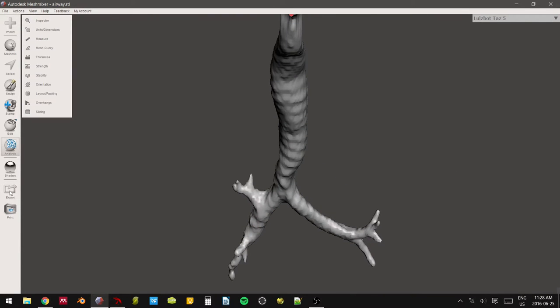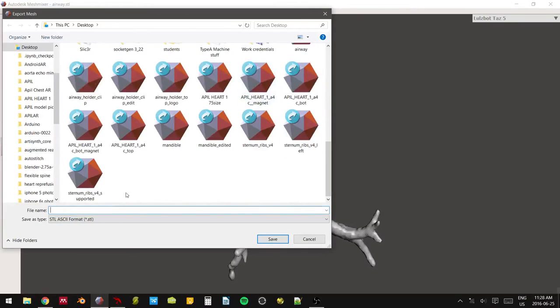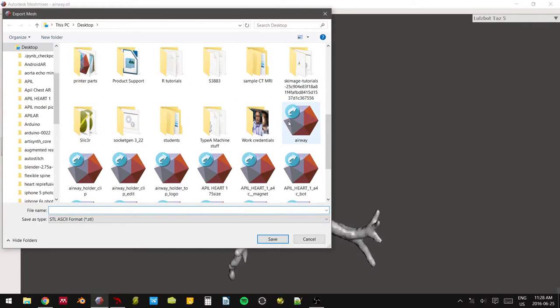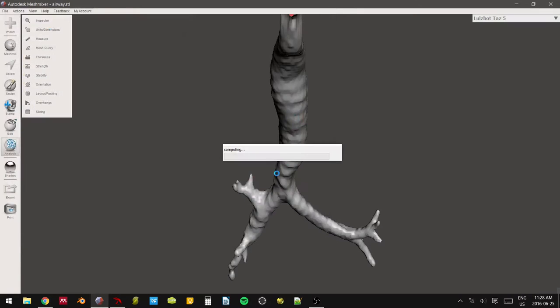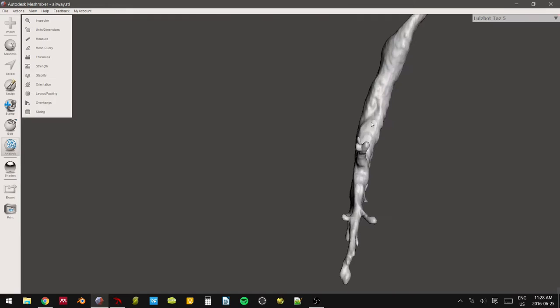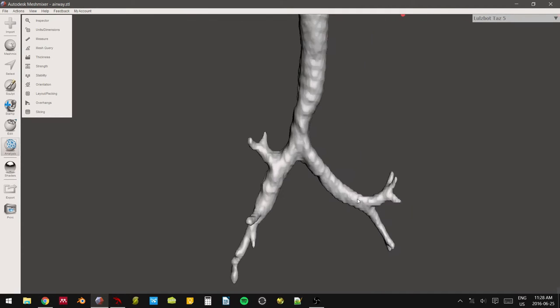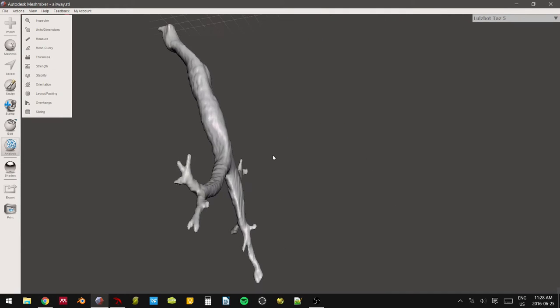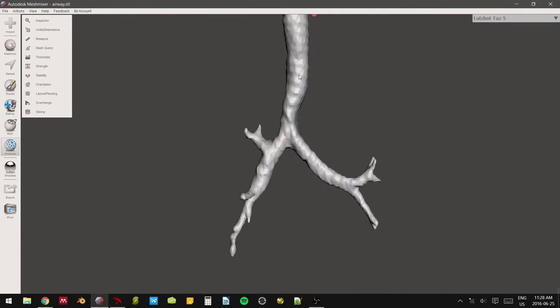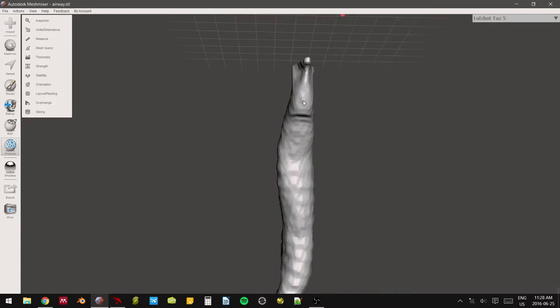So from this point, we're going to export this as our main file. So find it, airway. I call it a second name, edited. And we'll hit save. That way if we make any mistakes in the future, we can just always go back to this file. And not have to delete those crappy parts that we accidentally left in at the onset of this.